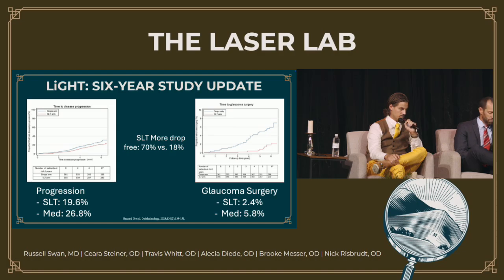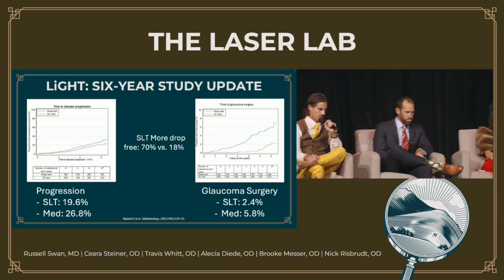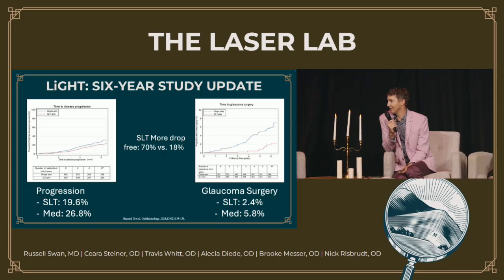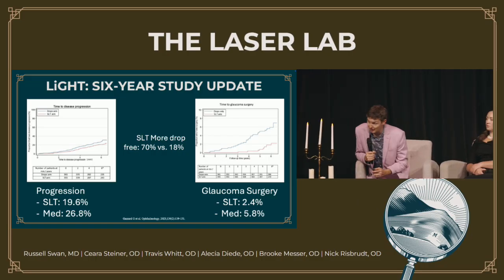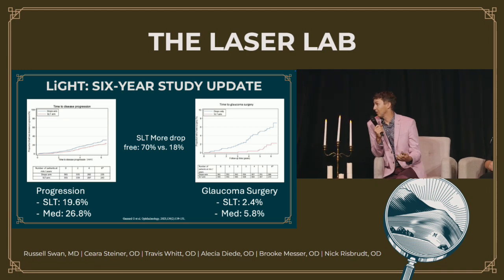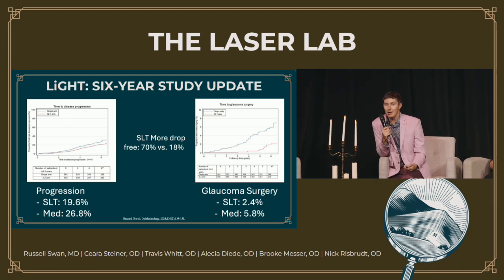And one of the things that Travis brought up when we were doing the glaucoma talk is that it is ingrained, and you oftentimes will hear even us say, or doctors say, or patients say, I'm just going to do a drop. It's safer and it's easier. And I think on the easier part, it's not easier because they're not compliant. And on the safe part, this is where the LIGHT trial 6-year data is the most compelling data to say, hey, we should be doing SLT as primary treatment.